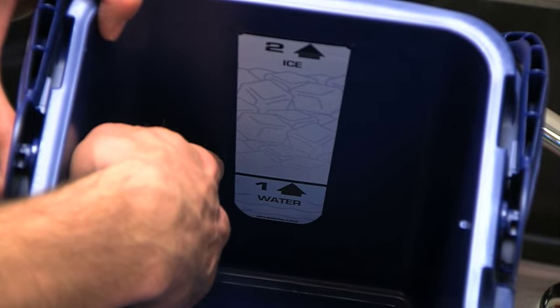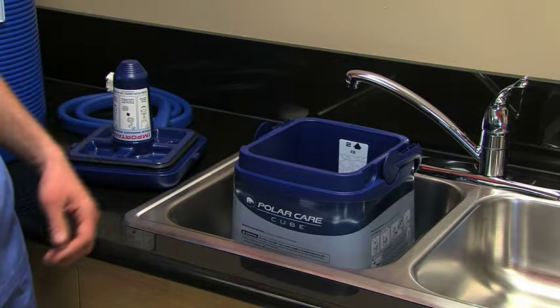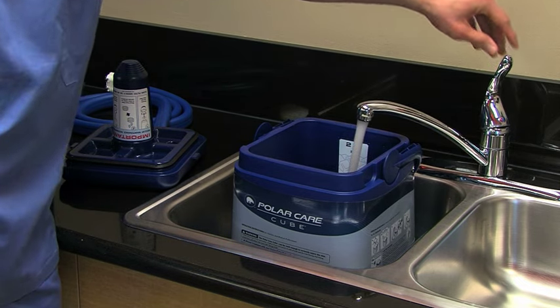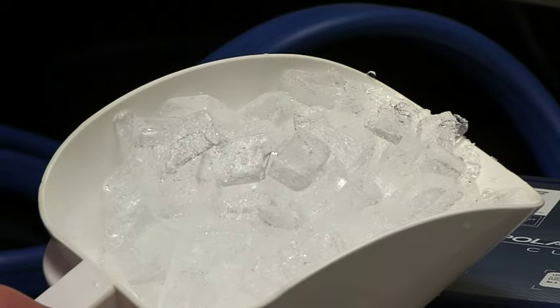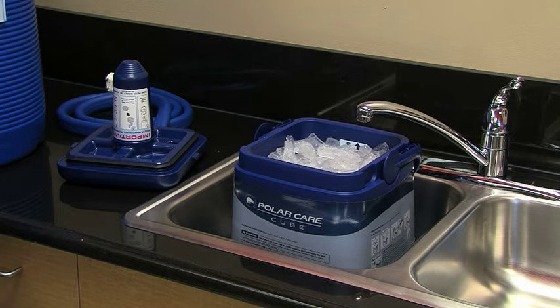Next, fill the unit with cold water, then ice — not the other way around — to ensure you maximize the ice time. Generally speaking, larger ice means longer ice time. Using the ice shown here, the water in the cube will stay under 55 degrees Fahrenheit for 6 to 8 hours.